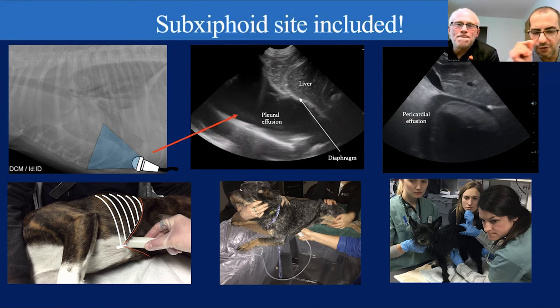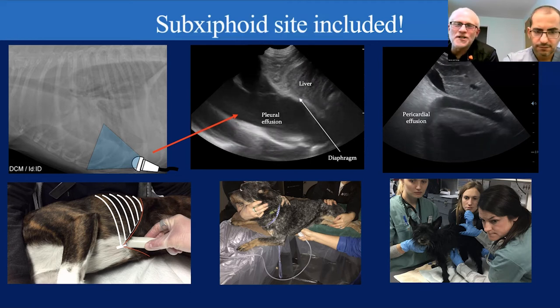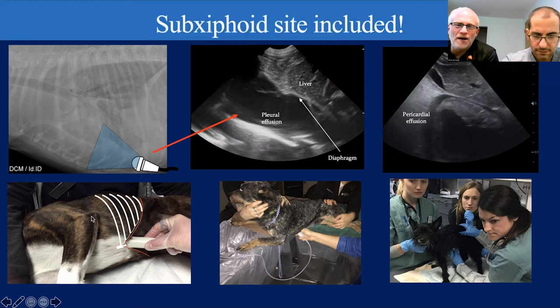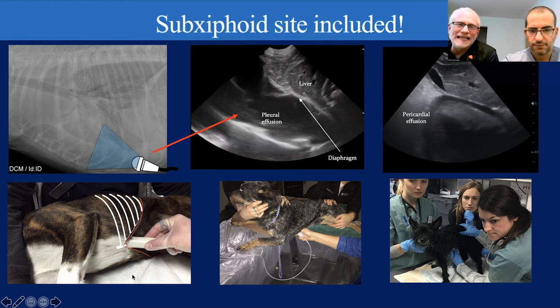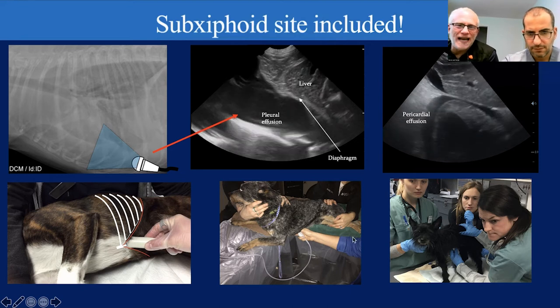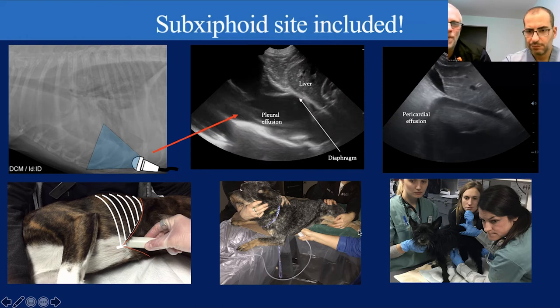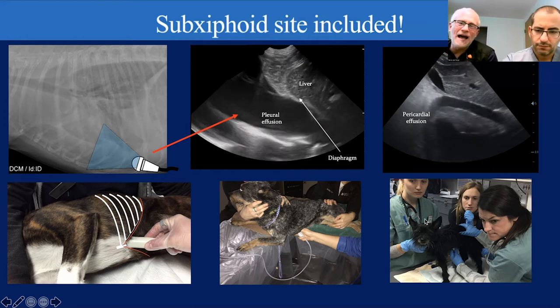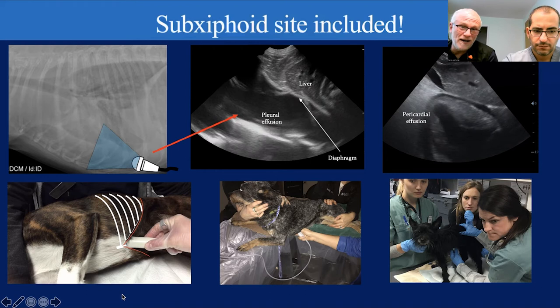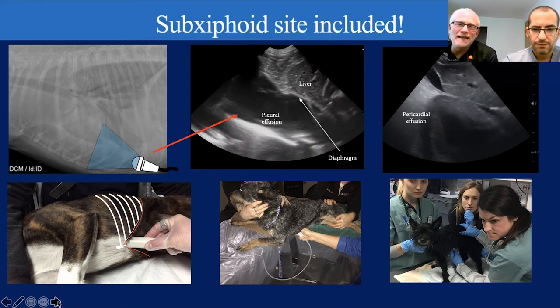Dr. Boysen, are we stuck with one patient position only? And again, scan the patient in the position the most comfortable. We got three different patients down here, all dogs. Lateral recumbency, easy to find that spot. Sternal with, say, hip fractures, for example, where you don't want to stand the patient up and he's not comfortable in lateral, you can put two tables together, make an L shape and come in from that ventral midline. And you got to see our students here now who are veterinarians who are scanning at the subxiphoid site in a standing patient. So you can get this in any position.